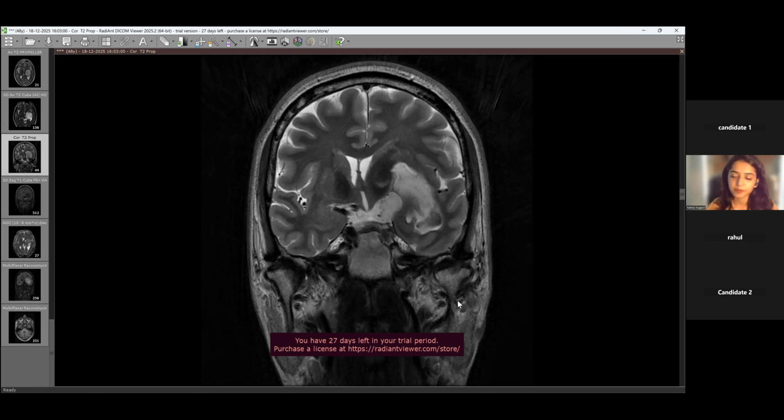Was there a history of trauma in that case? Trivial trauma. I couldn't catch some of the things you were saying in between. It was getting cut. But your approach was right. You did ask whether the patient had trivial trauma, and the examiner would ideally say yes, they had a trivial trauma. Either way, you were in the right direction. Nikita, just show the DISH case once.